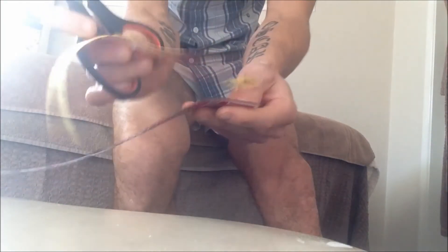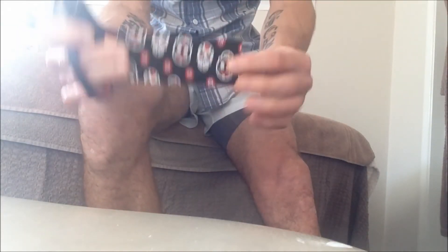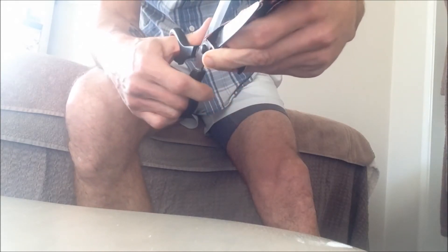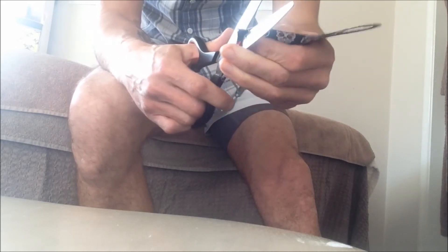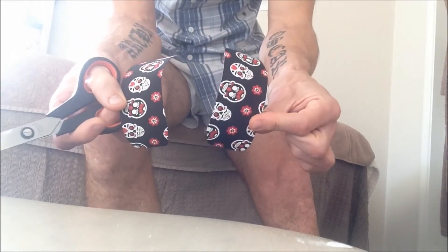For our second piece, the easiest way to do it is to measure it the same length as our first. Then we fold it in half, and once it's folded in half we can round off the edges. And now we have two more pieces.